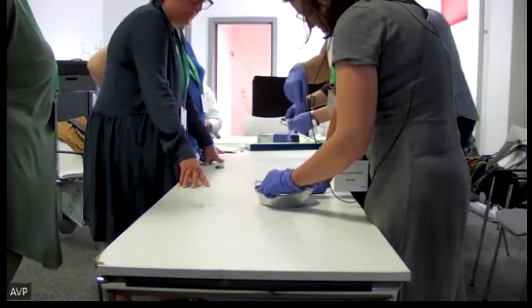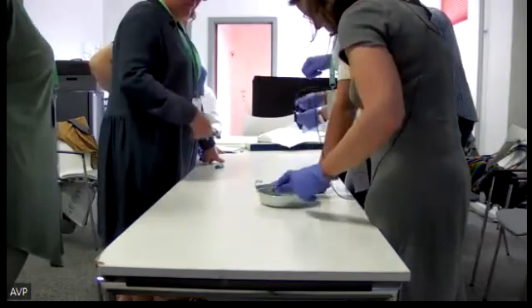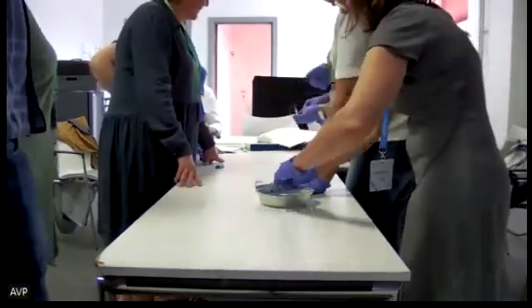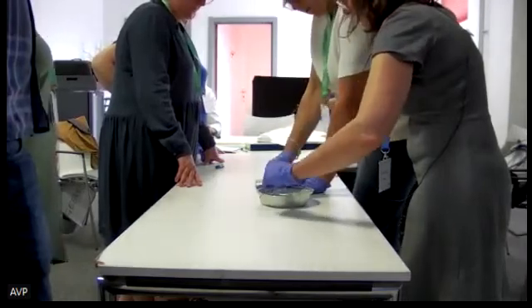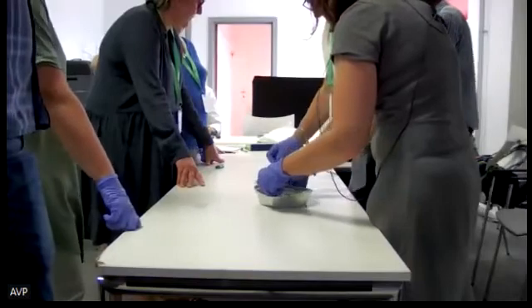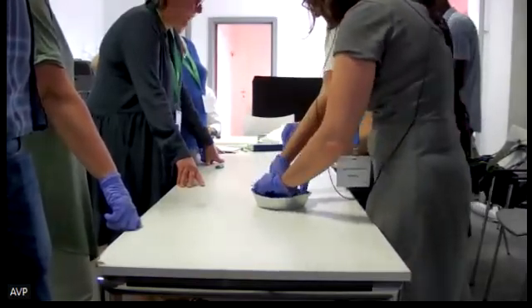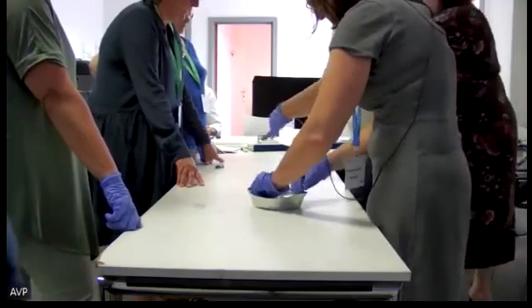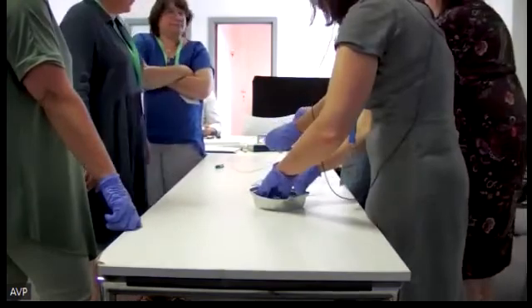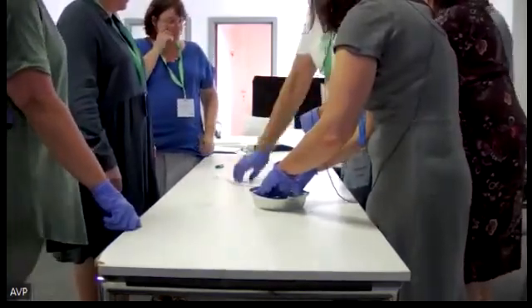So we put the second one the same way. When it's secure there, we can remove the big one. The big Bertha, we call her. She is pushing the two wires there. At the same time. When you are out of the scope, you can remove it this way. And then we have a wire ready for one stent and the other one for the other.